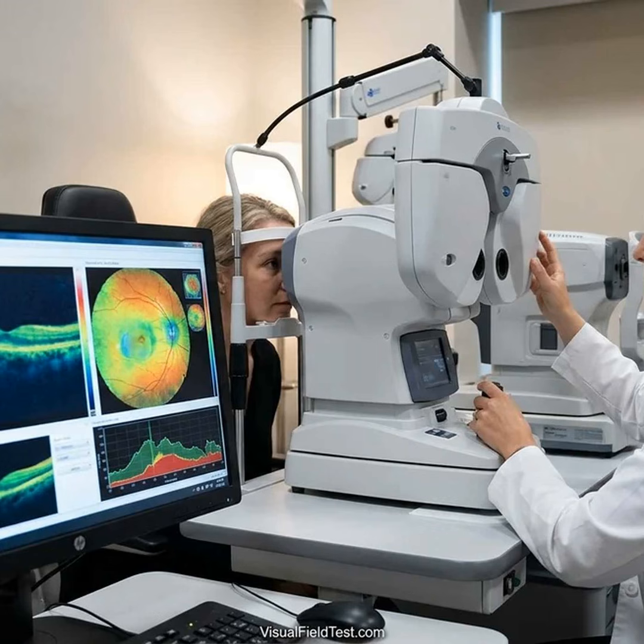A large multi-center study showed OCT detected progression in almost 60% of such suspect eyes over about 4 or 5 years, while visual field testing only showed progression in 27%. In early mild glaucoma cases, OCT in fact picked up changes in about 63% of eyes, compared to 39% detected by fields. This means OCT is often more sensitive than field tests in the very early stage of disease.